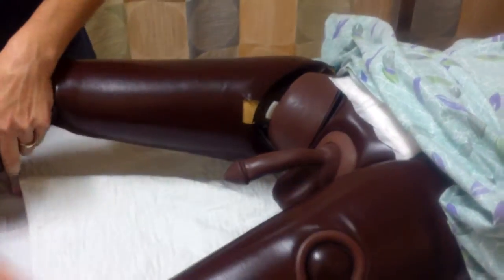As for agency policy, I'll get the pillow out of here. Sounds good. So then, once I do peri-care, that's when I do this.